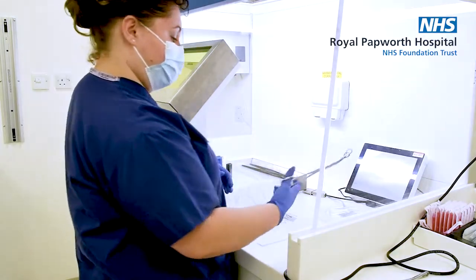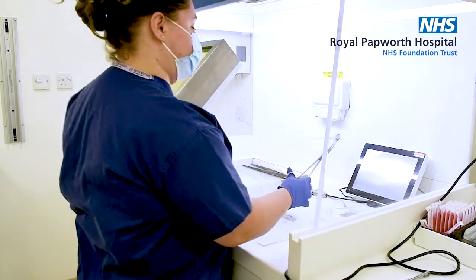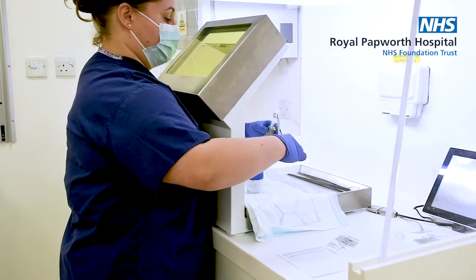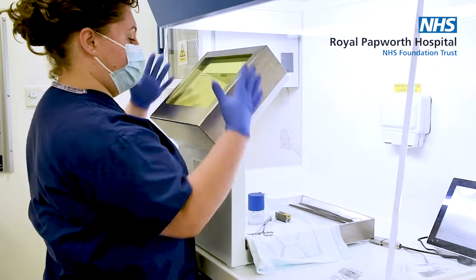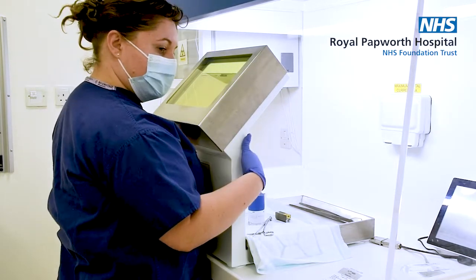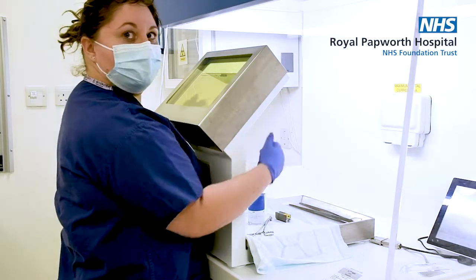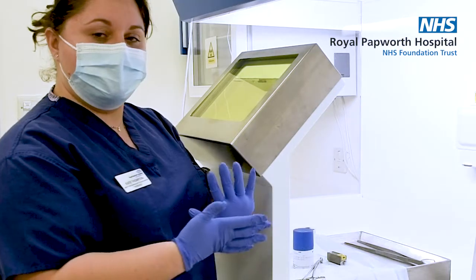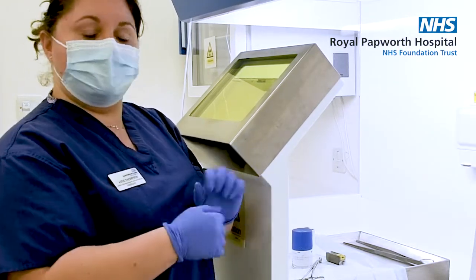It's important when we handle the isotopes that we use tongs to basically maximise the distance of the radiation away from our hands until it's back into its shielded cover. This glass screen in front of me is also made of thick lead, which protects any eye dose that I may get from drawing up. Once completely drawn up, we should always monitor our hands to make sure there's no contamination on them before we go and touch something else.